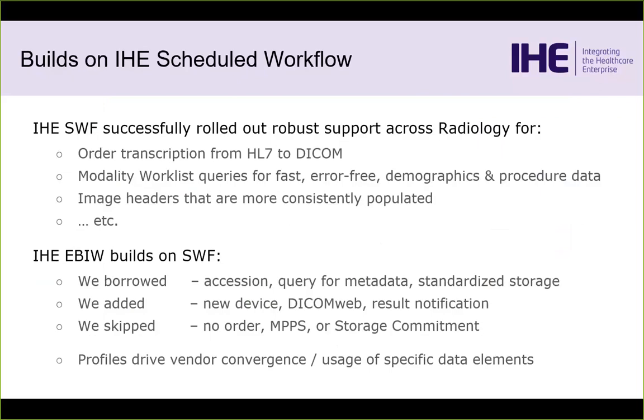Now, the good news was that we had a template to work from. IHE Scheduled Workflow is, in fact, the first profile that IHE did. Radiology was sort of the starting point of IHE. Scheduled Workflow was the very first profile. And it's been rolled out.